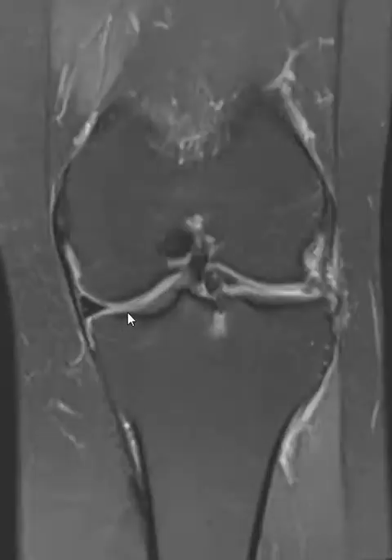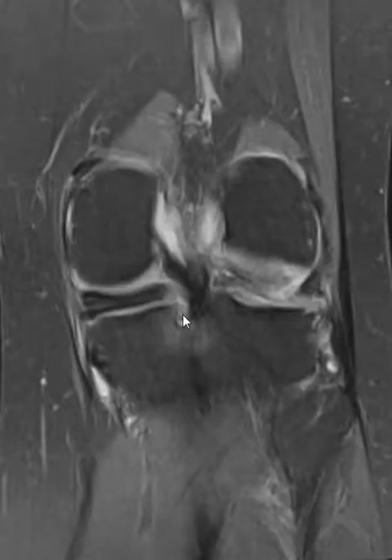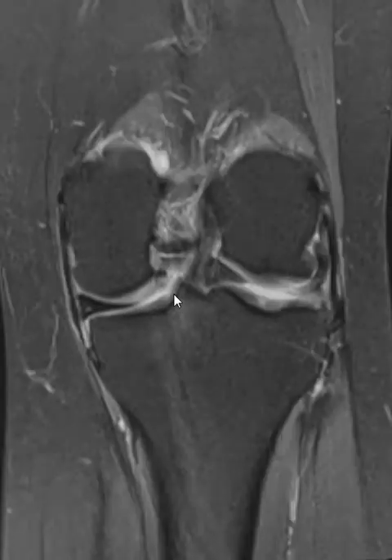If you look back over here, you say, well, the posterior horn looks pretty good. The anterior horn looks pretty good, but this is a case of a tear of the meniscus root. So the medial meniscus posterior horn comes over here, and the root attaches right over here by the base of the PCL. And the meniscus root, there's a vertical bright signal here. So this is a radial tear of the meniscus root. It's torn off the bony attachment and drifting outwards.